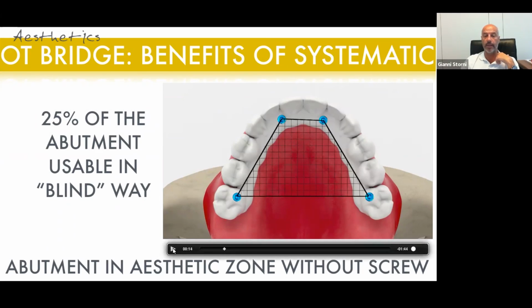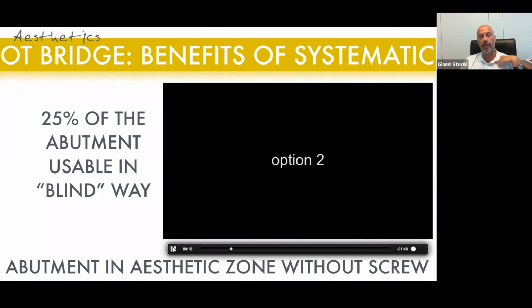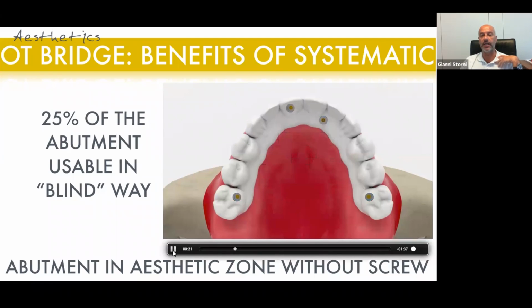For example, yes, one advantage is that if you remember, there is the Seeger ring that is retaining the abutment in place a lot. For that reason, in case we have no room, for example, here there is one standard solution. We have 4 implants. No implant is giving us an aesthetical problem, so we choose to use all 4 screws and Seeger with no problem.